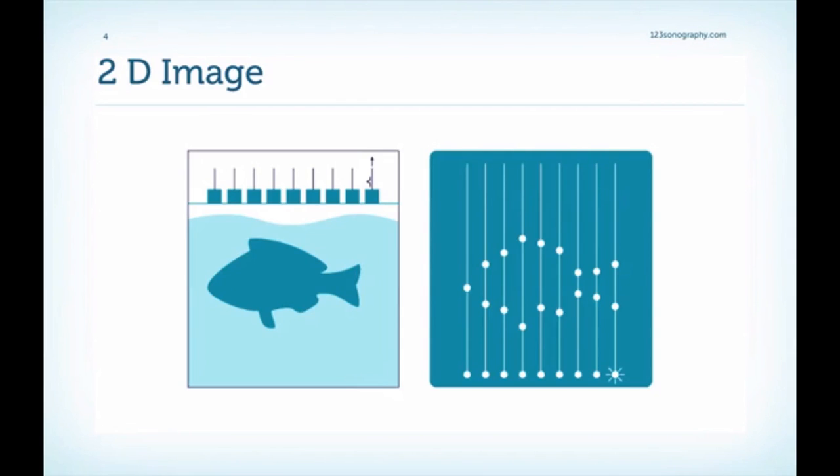We have to understand the principles. In the previous chapter, we discussed how the ultrasound wave is reflected when it hits a boundary. But how can we now build an entire image with the help of ultrasound? Well, to do that, we need not only one transducer or one crystal, but we need several, many as a matter of fact. And each of these crystals fires a beam and then waits for a reflection, and when the reflection returns, it does that one after the other successively.